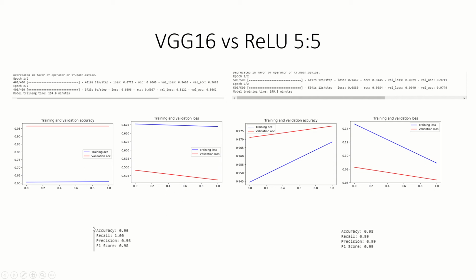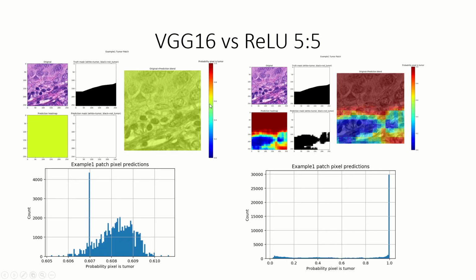You can't really tell from the validation accuracy, but in the confusion matrix result, you can see that the miniature version of VGG16 that I implemented worked better. And this is transfer learning, so I only had two convolution layers that I could fine-tune, and the rest of the parameters were fixed. VGG16 doesn't perform well at all with transfer learning.